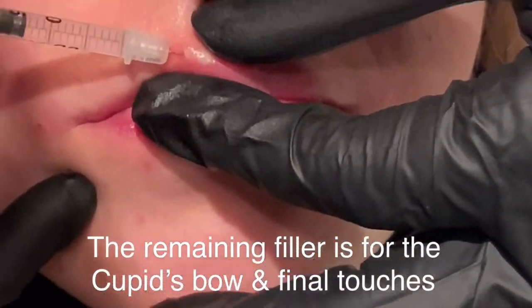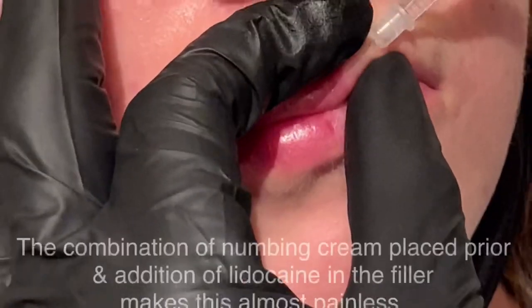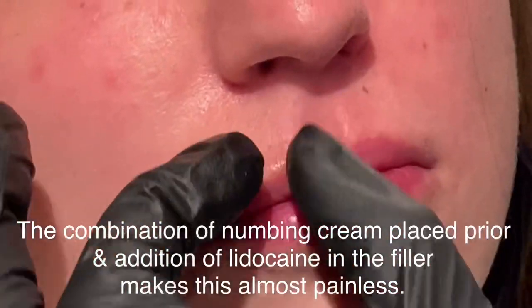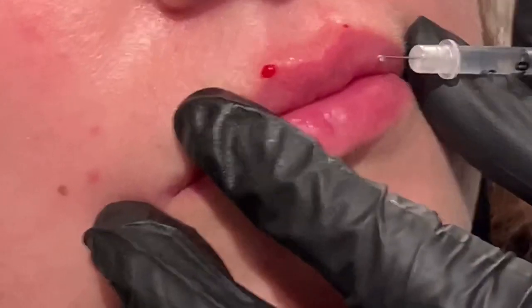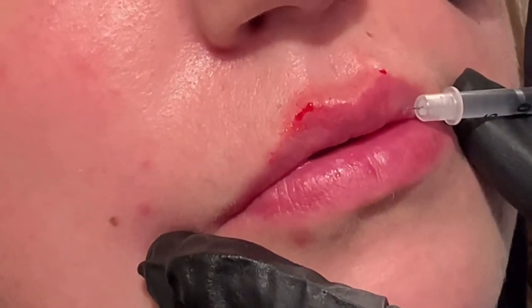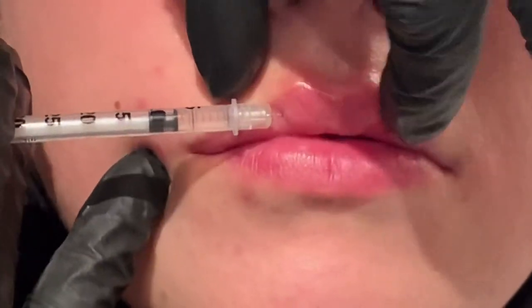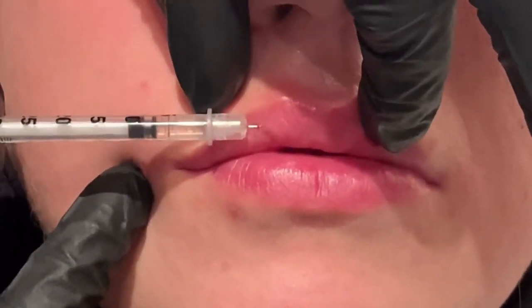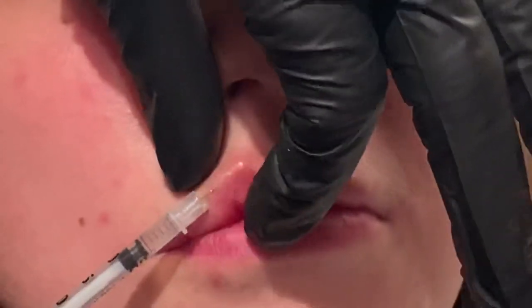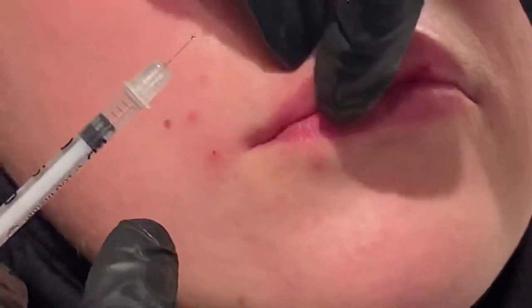For the final touches, I transfer the filler to a BD syringe. This allows me to sharpen the cupid's bow and touch up any asymmetries. You might notice that the client doesn't even flinch when I touch it with a needle. That's because I've asked her to place numbing cream on about 20 to 30 minutes before the procedure, and most fillers nowadays have lidocaine in the filler itself. So going in with the cannula, adding filler with lidocaine in combination with the numbing cream makes these final touches virtually painless.